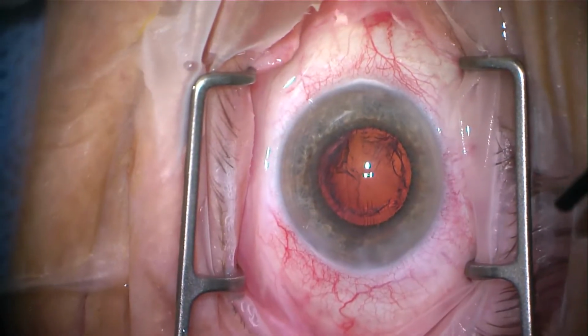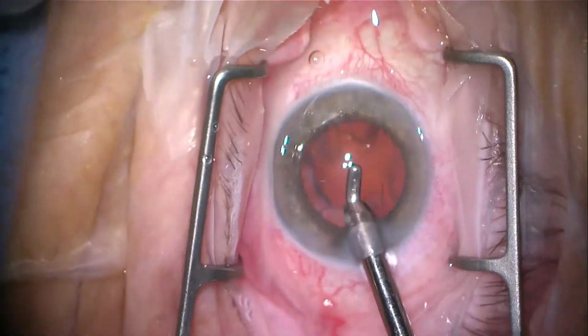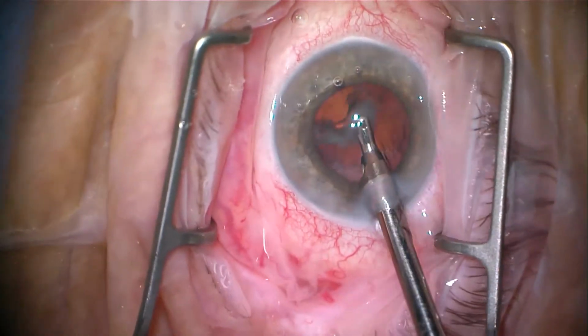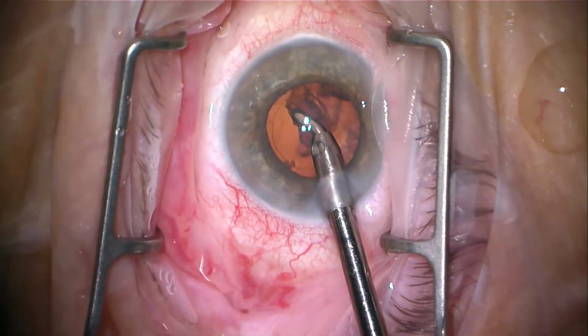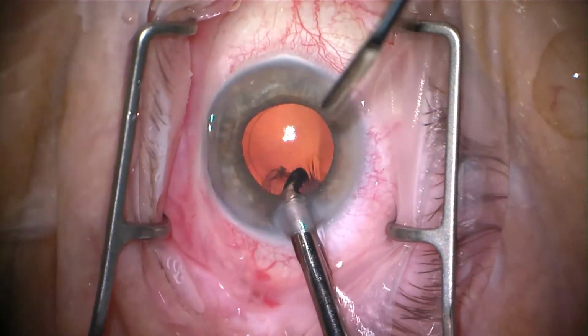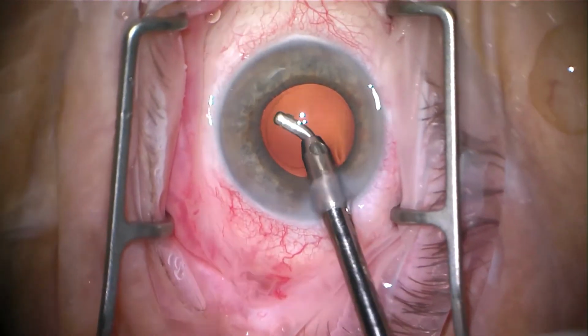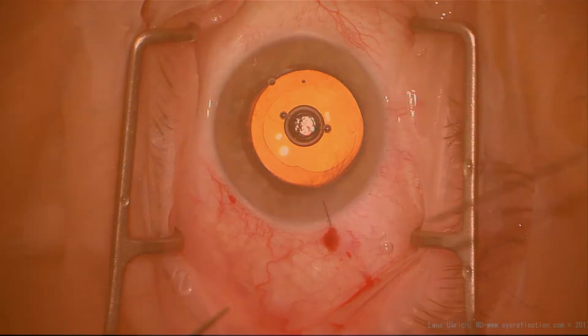After that's done, and we're about to do I/A, you can still see the pupil is doing well. It's a little bit more reduced in diameter, but for the most part, it's still quite dilated. Certainly have excellent visualization. And then after that, we'll go ahead and slip in my lens, which I won't show you. And there's the end of the case. We put in a stitch because of my concern that she might be also Vigamox allergic, which she didn't prove to be, but 21 minutes in and still great dilation.